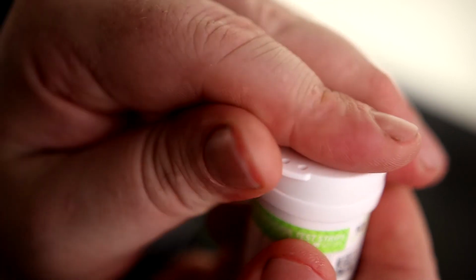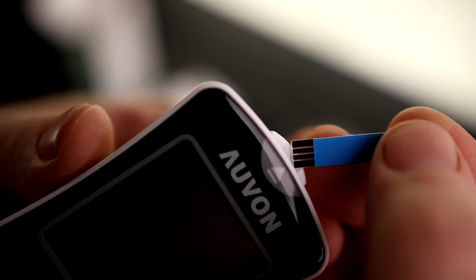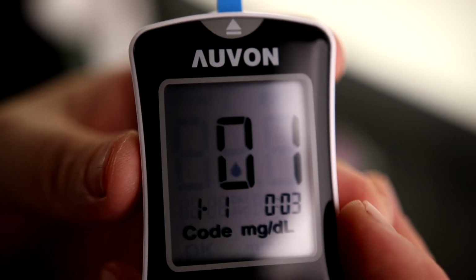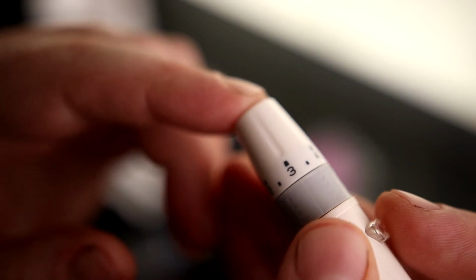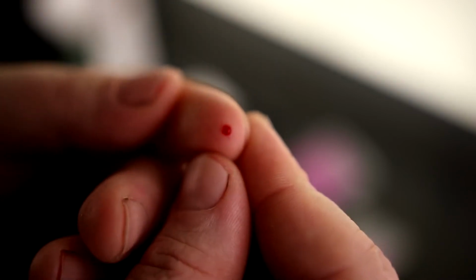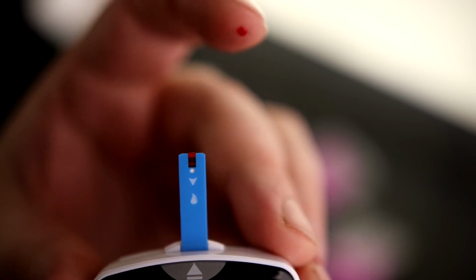So now I will take one of the testing strips. You want to make sure you got clean hands whenever you're doing this. And we're going to put this strip in the top. So it'll automatically turn on when it sees it. Put the lancet against your finger and pull the trigger. There you go. It just feels like a little pinch. And then kind of squeeze your finger, get a little blood out. And we don't want to put it on the front, we want to put it on the top. There we go.